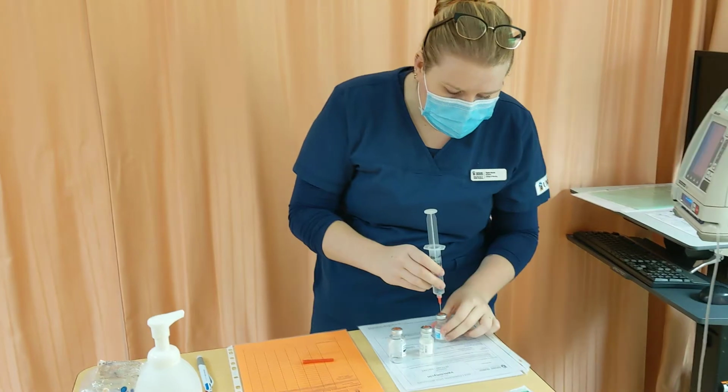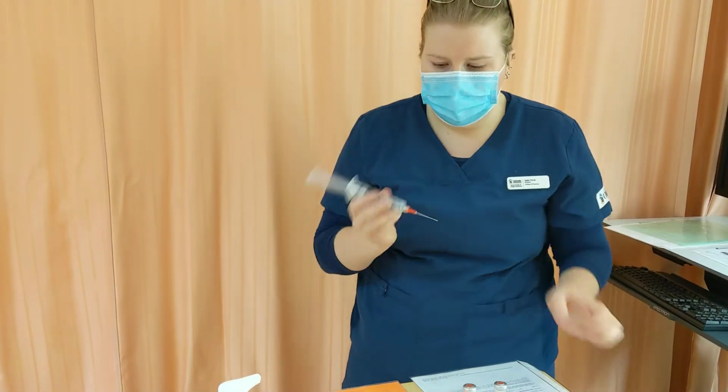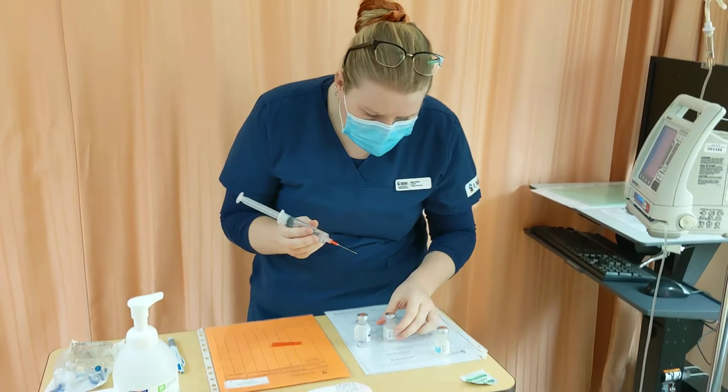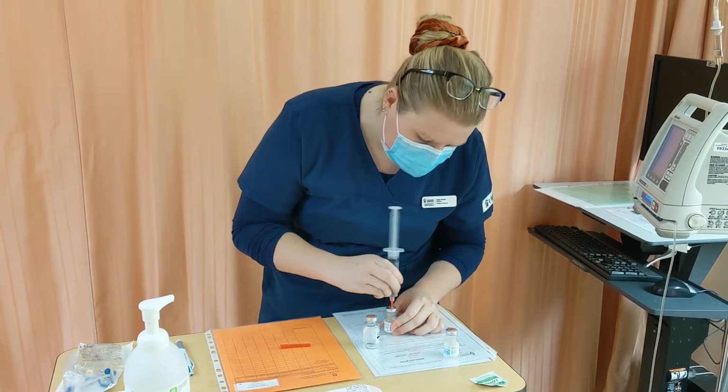Once I've got all I can get out of this one, I'm going to draw back the 20 again. And like I said, I've already cleaned this.